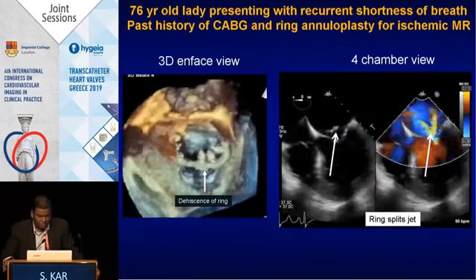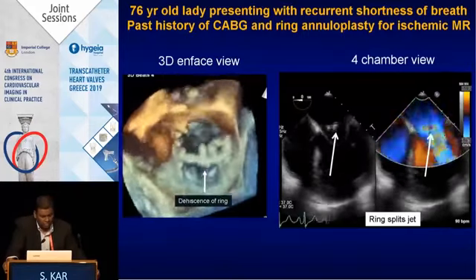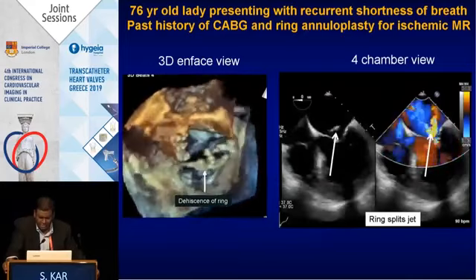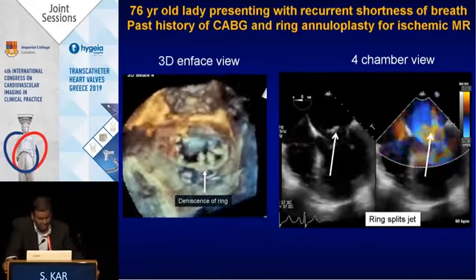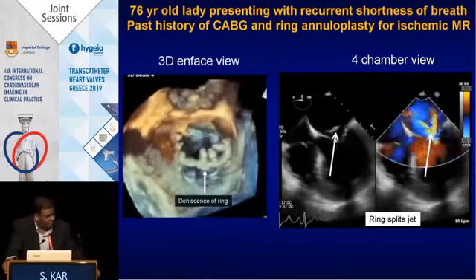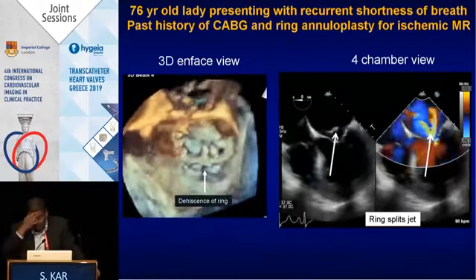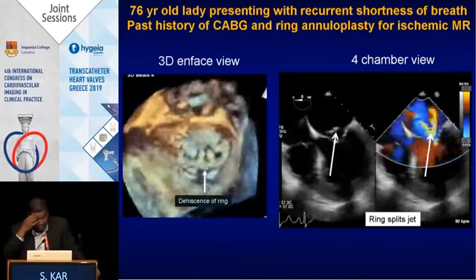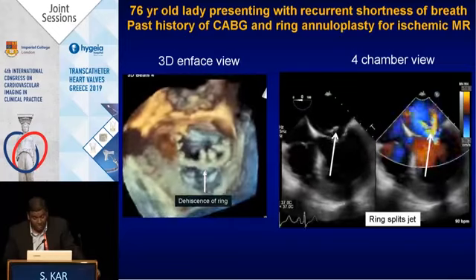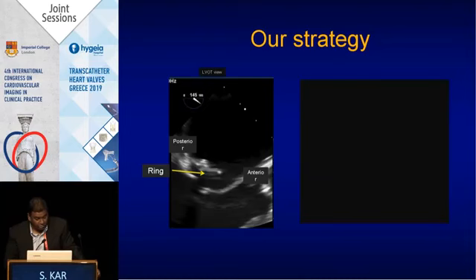The patient presents with severe mitral regurgitation a few months after surgical repair with CABG and ring annuloplasty. I looked at the echo and couldn't understand what it was. I see this severe MR, and I see something sticking out in the middle. Then we did a 3D and we can see that the ring has come off the posterior wall, so it's right in the middle of the valve. We said, what are we going to do with this? We can't drag the ring out. The redo surgery is quite difficult in a patient who's had CABG before. It's ischemic MR, so we considered a MitraClip.